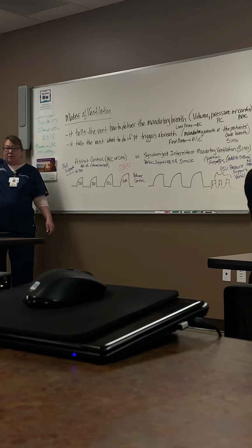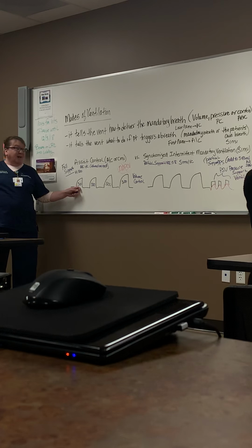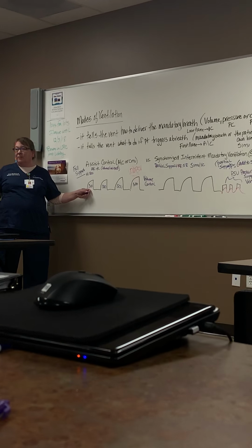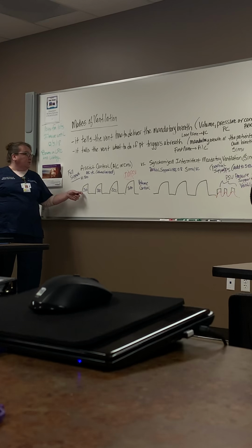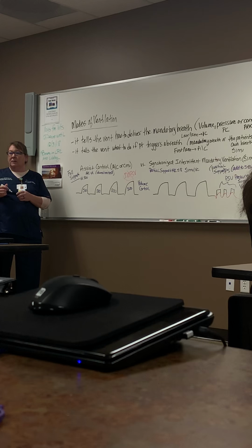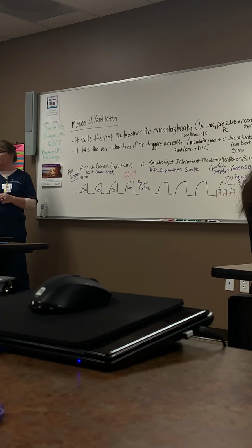So when you go to those patient parameters to see what's actually being delivered, you never see an exact number based on what tidal volume is set. It's just gonna be close. There's always a little extra flow in the circuit, and volume, and things like that. So it's never gonna be exactly 500. How close is close? We set our alarm limits to be within 100 above and 100 below. So that's fine.